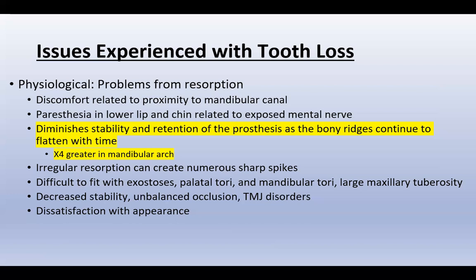Dissatisfaction with appearance can happen as well. They might not like the way it looks. Everything looks maybe too perfect, or maybe they feel the teeth are too big, or various things like that.